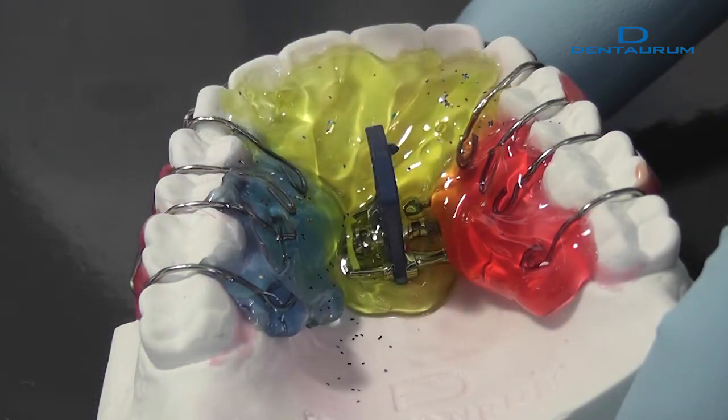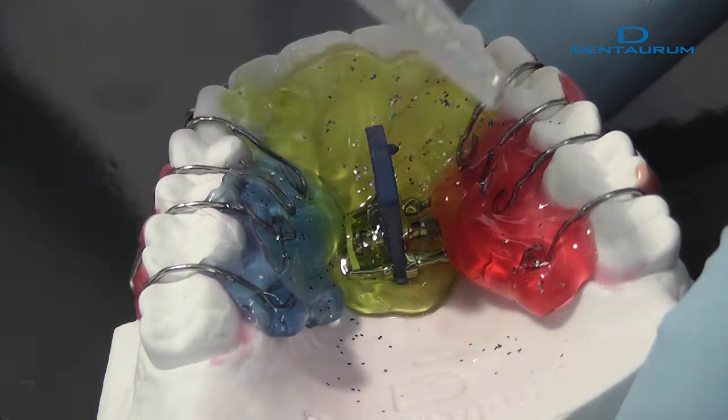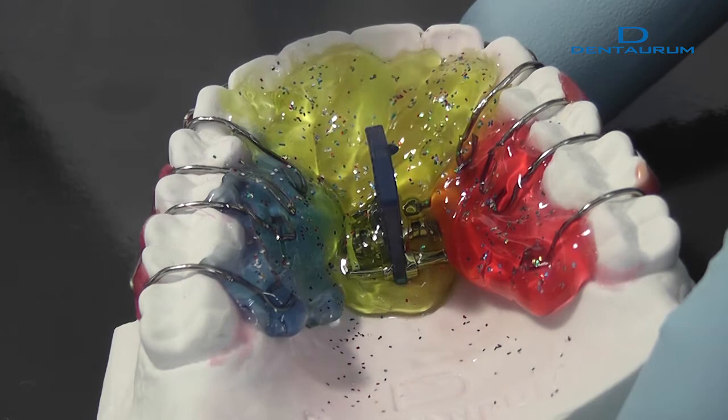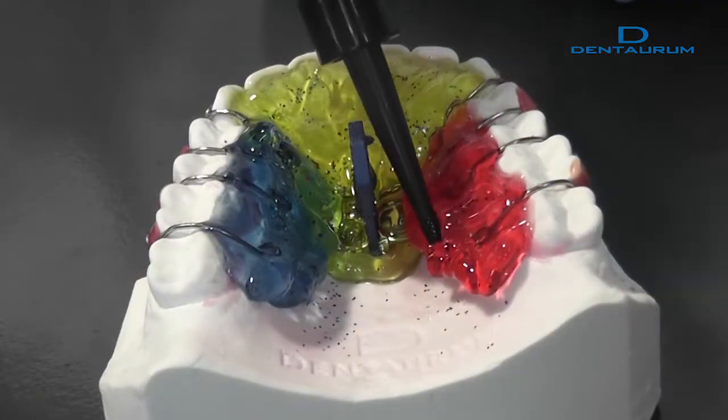Disco glitter is applied halfway through layering the acrylic. The disco glitter must be completely covered with OrthoKryl LC before the material cures.